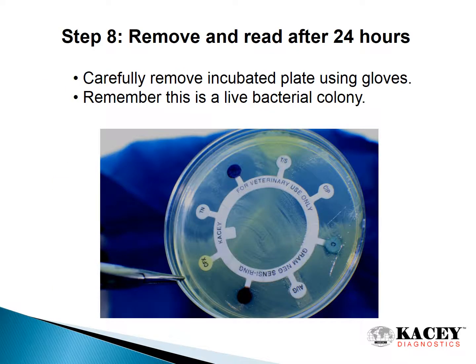Step 8. Remove and read after 24 hours. Carefully remove incubated plate using gloves. Remember, this is a live bacterial colony.